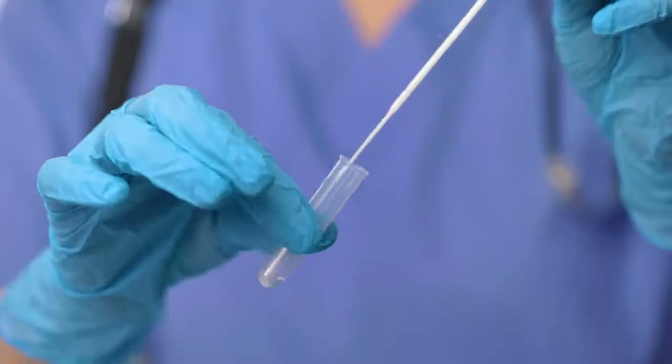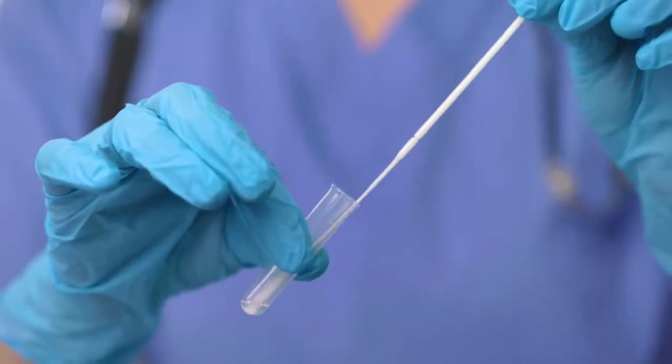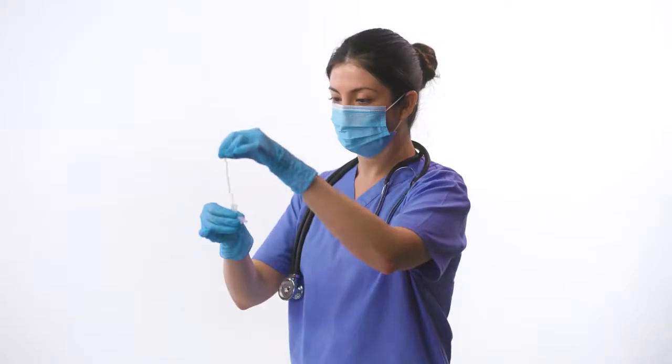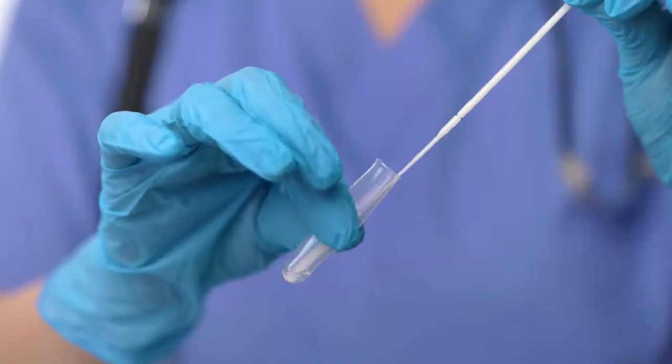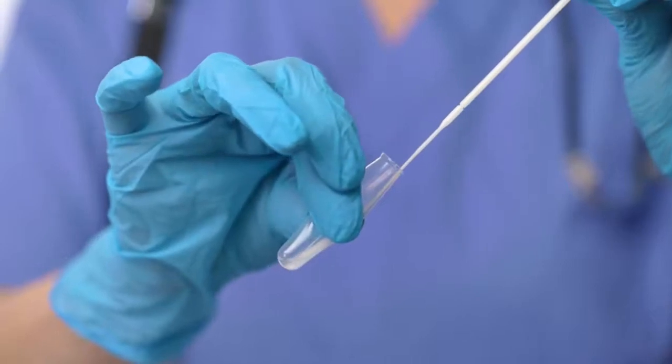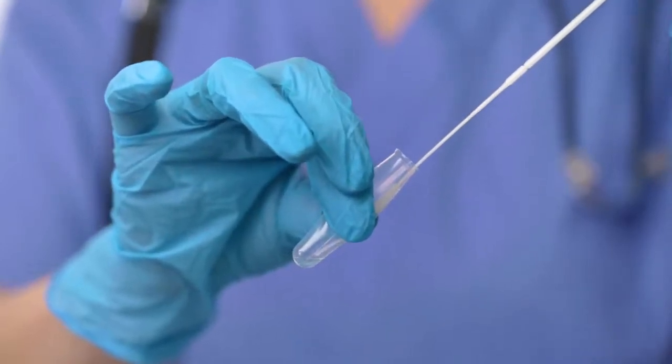After the sample is collected, fully immerse the swab into the buffer liquid in the extraction tube and rotate it around for at least 15 seconds. As you remove the swab, press it against the sides of the tube, removing as much liquid as possible.